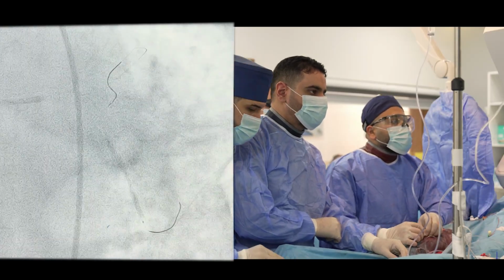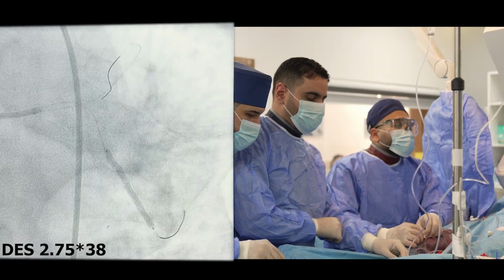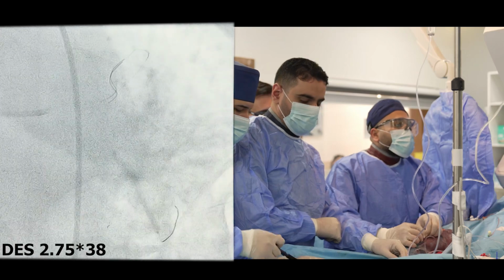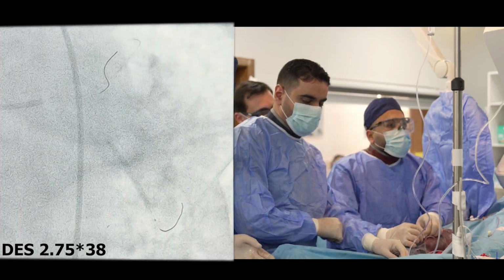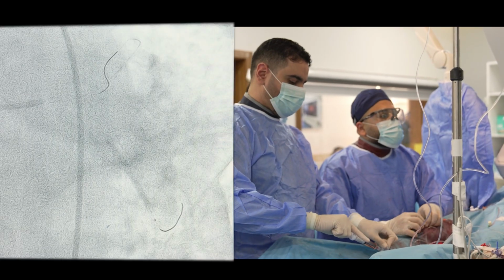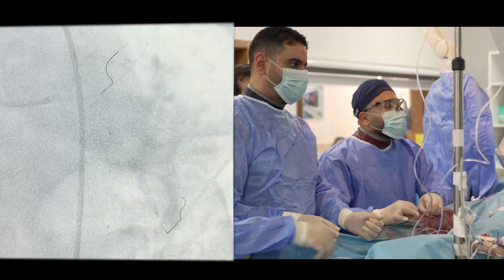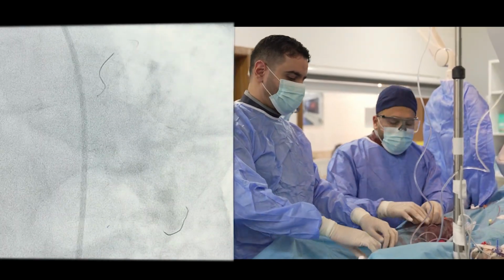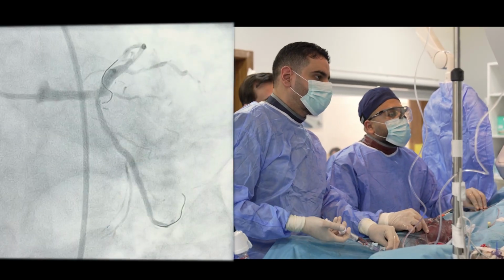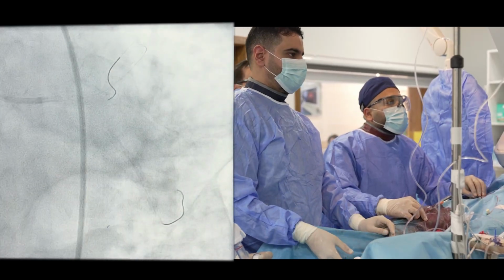12, go 14. 14, just 14. Okay. 14. Off. Take it out and do some angio. Okay. Angio. Perfect. So let's decide about the left main.